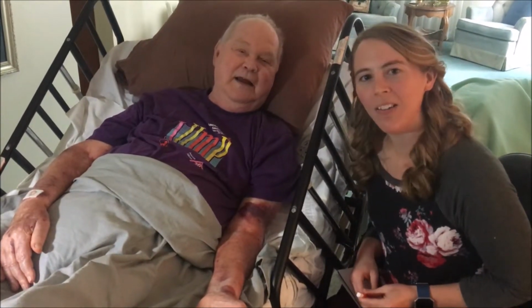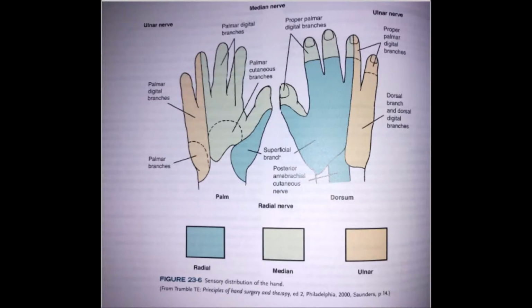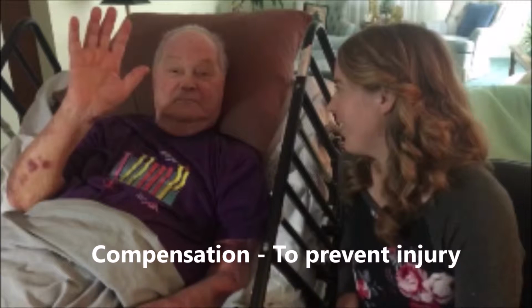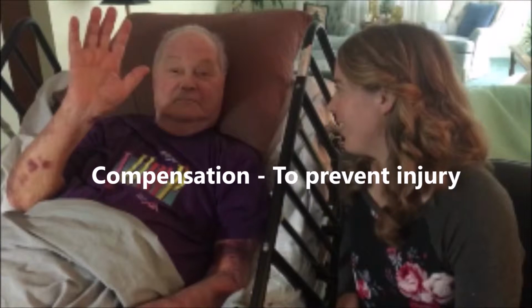All right. So we're all set with the monofilament assessment. I printed off the hand grid that I demonstrated to you earlier to help demonstrate the information gathered in the monofilament assessment. As you can see, the areas shaded in purple demonstrate diminished protective sensation. Using our knowledge of the innervation in the hands, we can see that the ulnar nerve may be affected by Grandpa's condition.